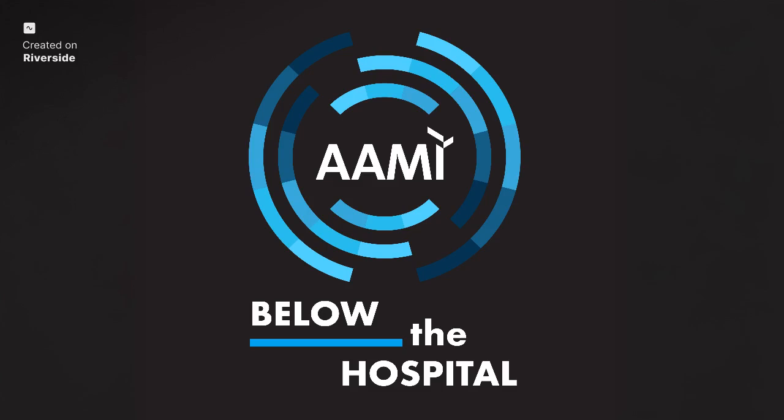In other words, IFUs are developed based on rigorous testing and validation processes conducted by the manufacturer, because as a manufacturer, we are required to conduct this testing to ensure that our instructions lead to proper device performance and safety. As I mentioned earlier, the process involves input from engineers, regulatory experts, clinicians, sometimes sterilization professionals, and each IFU must comply with national and international standards as well, such as those set by ISO, AAMI, or FDA guidelines.